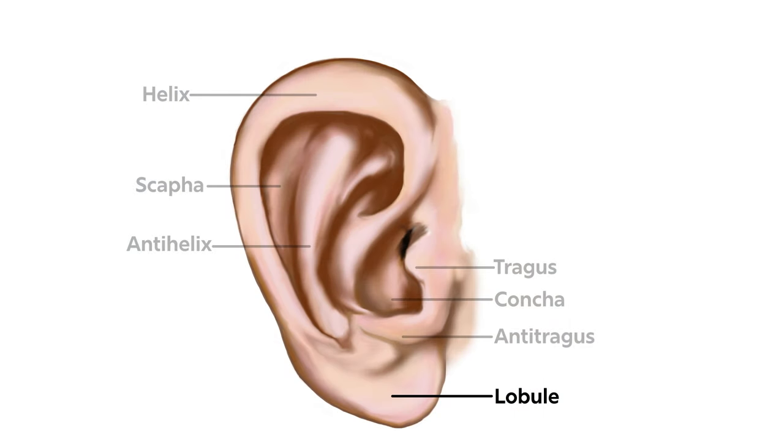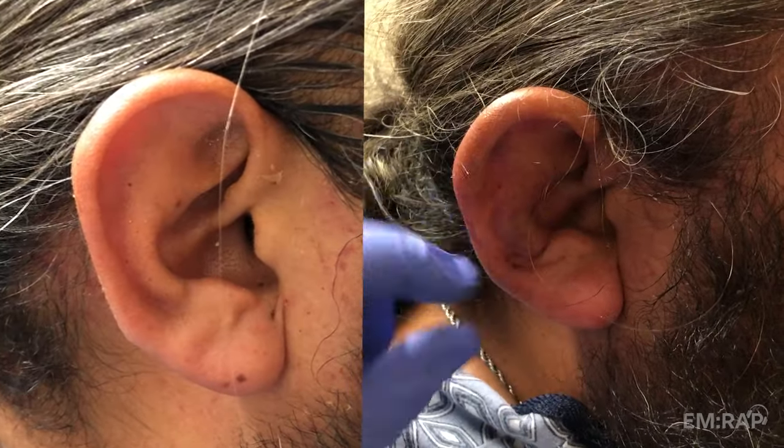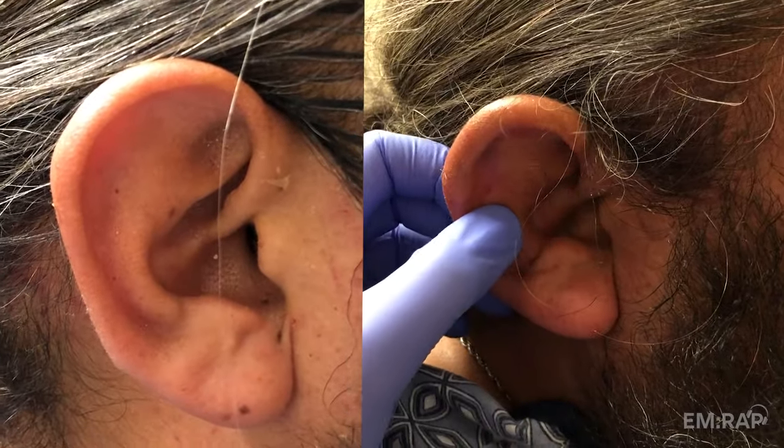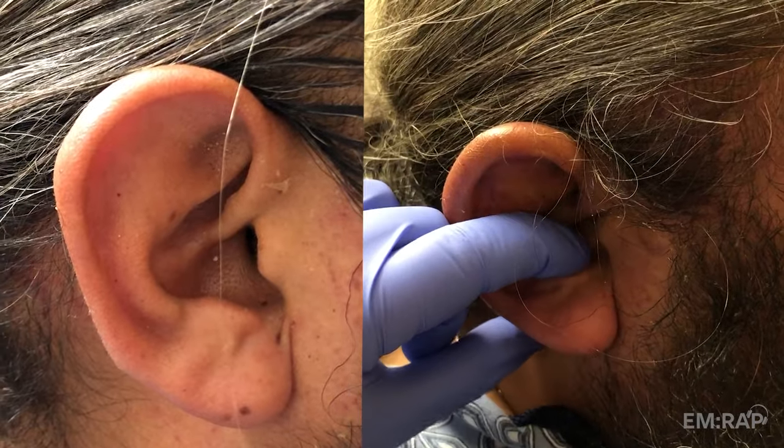The lobule of the ear does not have cartilage, so this area does not need to be drained even if it looks swollen. Comparing our patient's ears, you can see he is quite swollen along the scapha and anti-helix and in the concha near the anti-tragus.